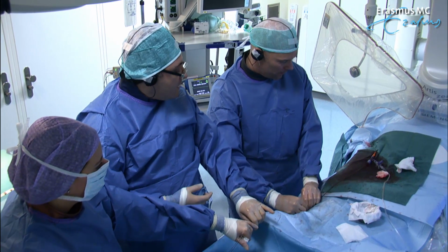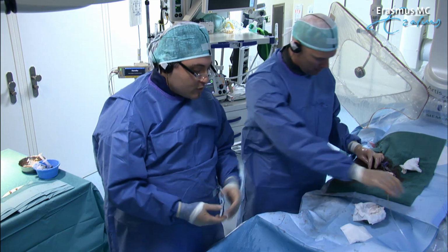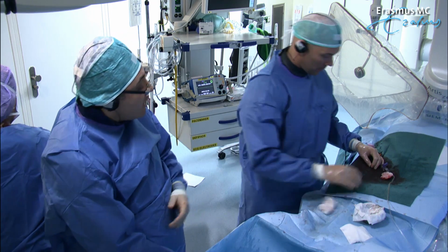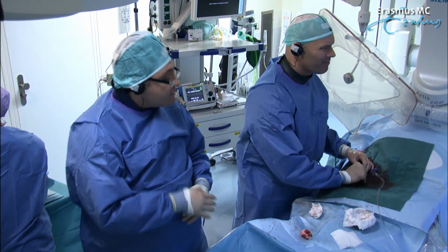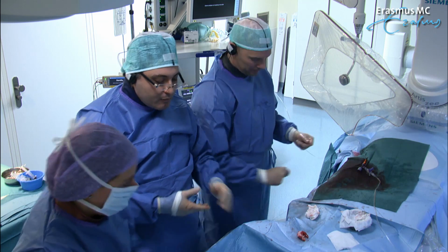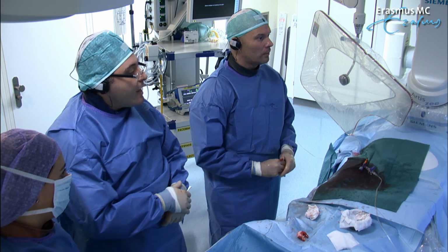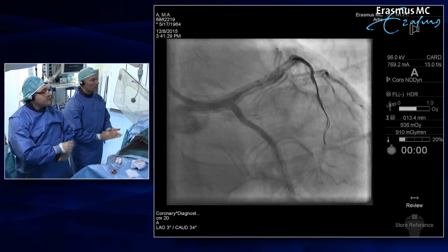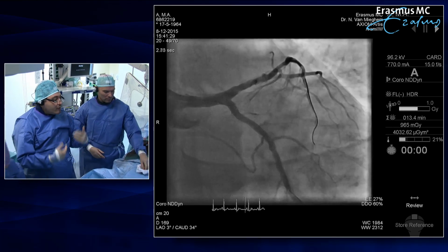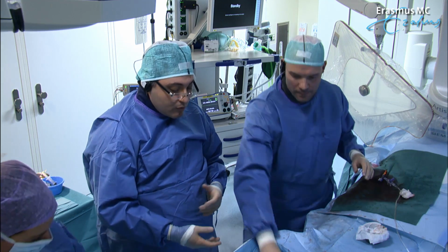So we are talking about FFR, and probably when we have residual stenosis or a pinching of the side branch, what do you think about doing an FFR of the side branch to assess it and to guide your decision on kissing balloon? We have seen some groups that actually are performing FFR in this kind of situation, and they perform the FFR in these pinched side branches, and then they did kissing balloon, and after that they repeated FFR, and they saw that the kissing balloon was improving.